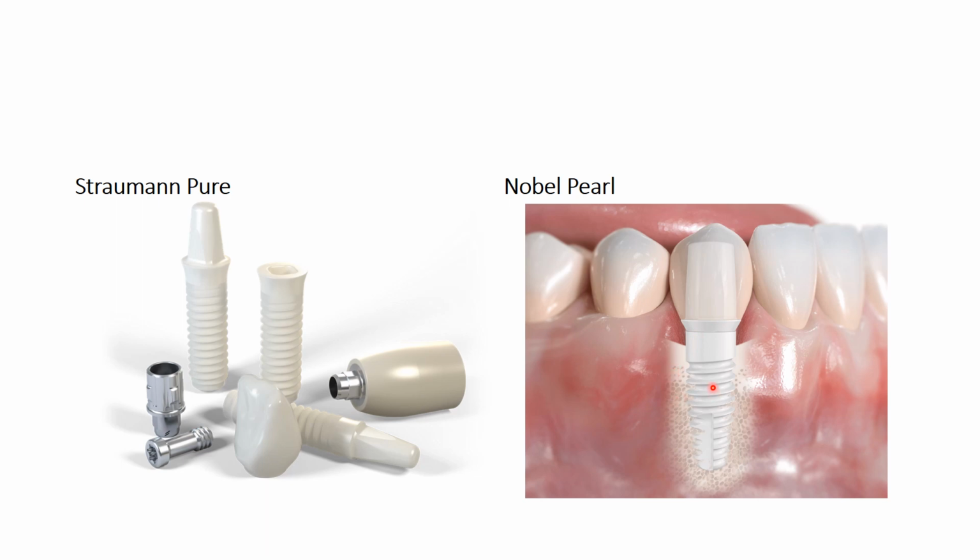These types of implants are mainly used in non-stress zones like the anterior regions, especially in the mandibular anterior and the maxillary anterior regions, where the bone is very less and the gingiva is of a thin biotype that may result in gray shadowing under the crown if a metallic implant and metallic abutment is used. So in these cases, these implants are very popular, and for those patients who are paranoid that they should not have any metal in their body, we can use these implants.